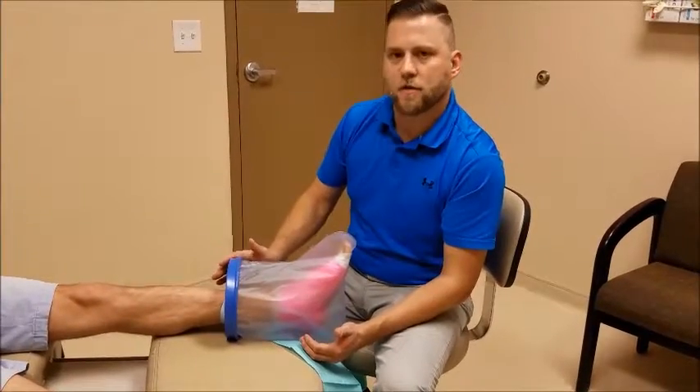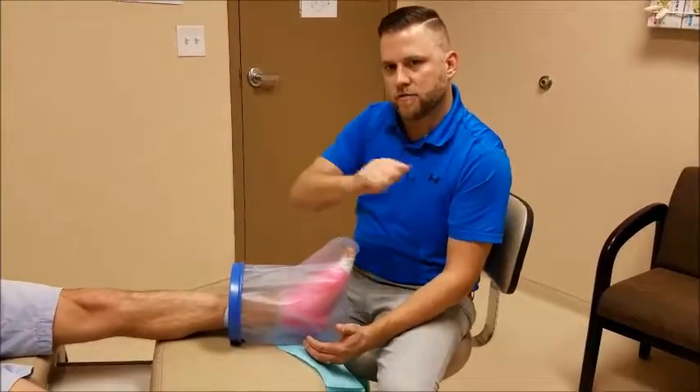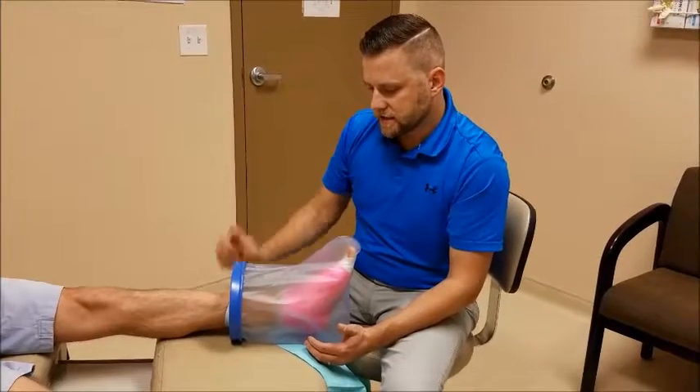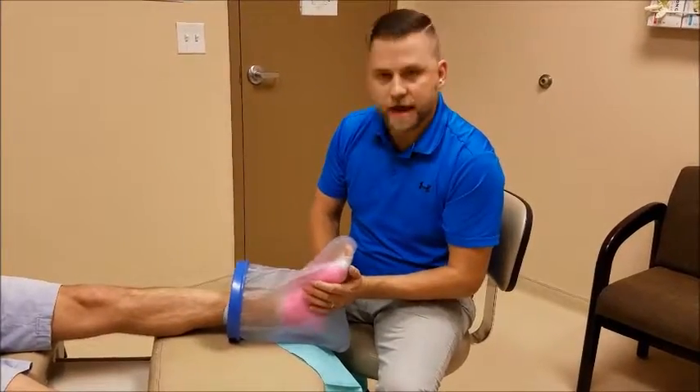This is very simple. Just make sure that when you're in the shower, if you have a wand, use it to keep the leg off to the side and bathe the rest of your body so water doesn't run on top of this. And that is the shower protector for a post-operative bandage or a cast.